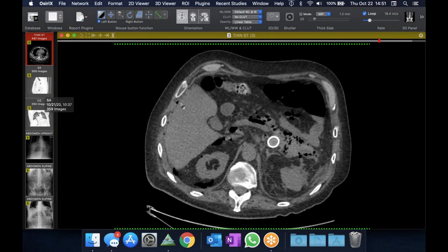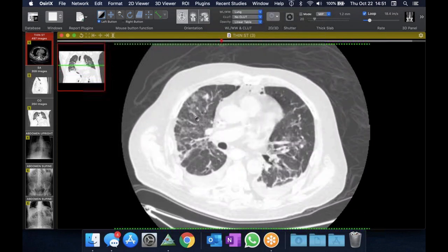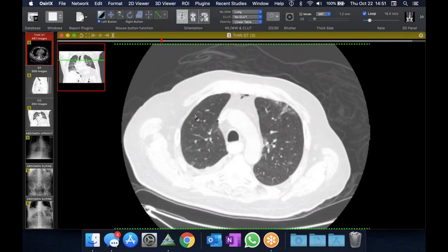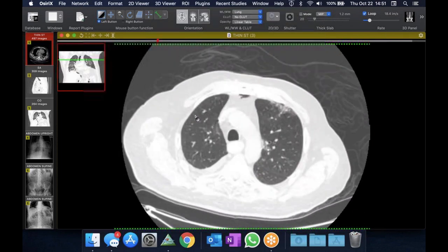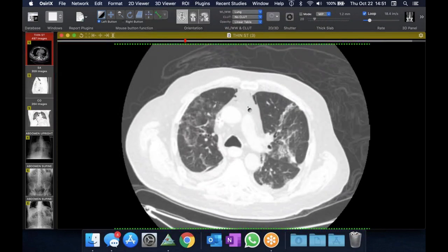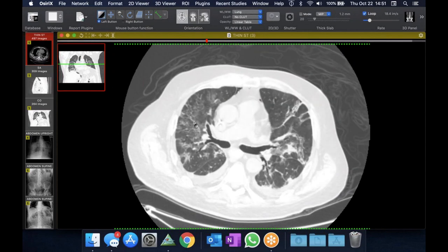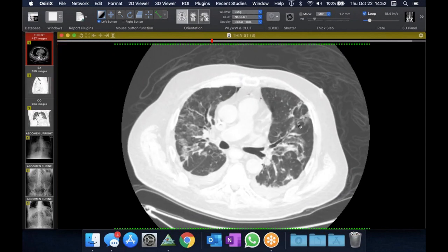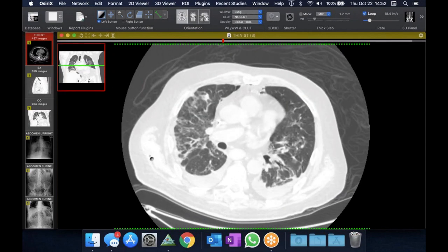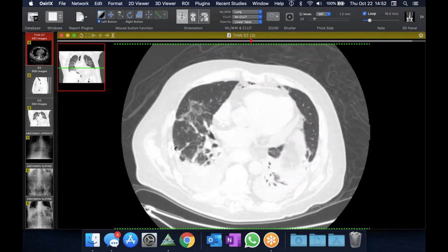The patient also has had COVID in the past, and you can see some sequela of that. The COVID was over a month ago. We've got some pneumomediastinum tracking up, presumably from the abdomen, but all of this is sort of a subacute lung injury here. There are some dilated airways. It may be transient, but I think this far out I'll be a little concerned there could be some developing fibrosis.